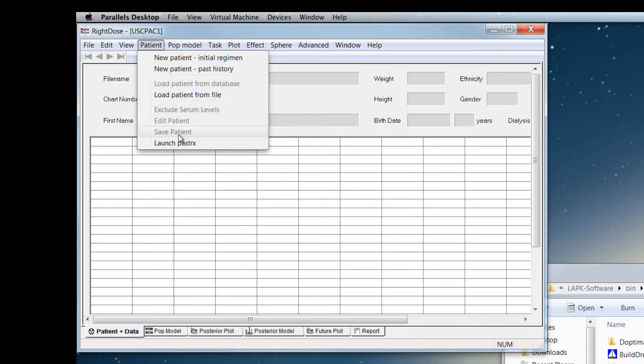You can also launch the patient data entry program PASTRx for PAST therapy directly here.